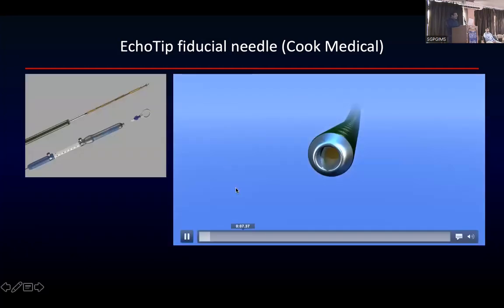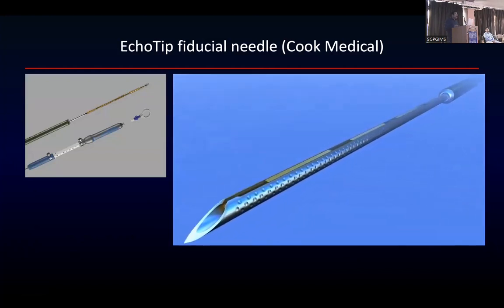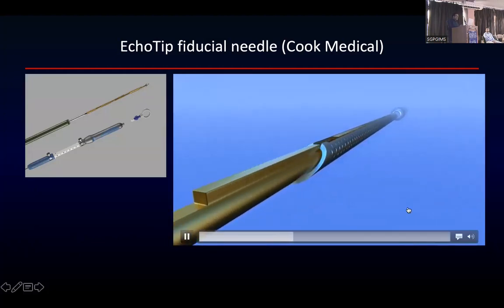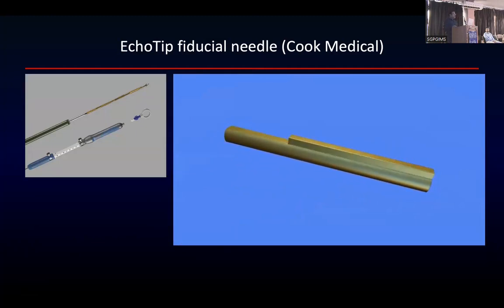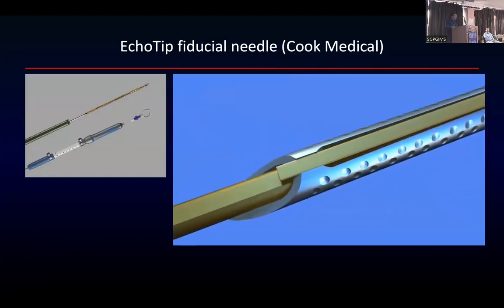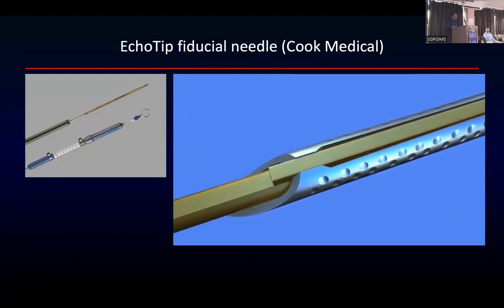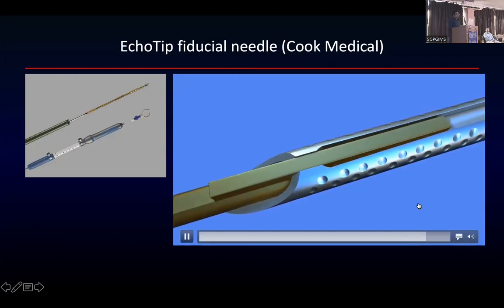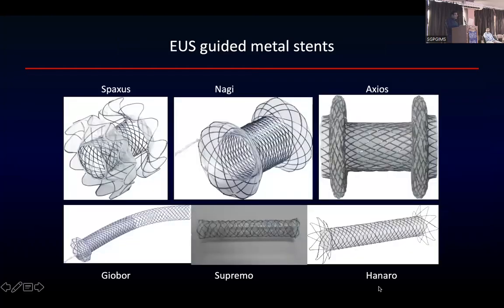So still we don't have this available. I was trying to get this, but the Cook people said that it's not yet available in India. But I think in the US they have been doing this for the last 5-6 years or maybe more. So these are the gold markers which come out through the FNA needle. This is how it looks, obviously a zoomed image. And 4 fiducial markers are preloaded in this Cook Medical FNA needle that you have. If you see this, it will come out like this. These are the markers that will come out.